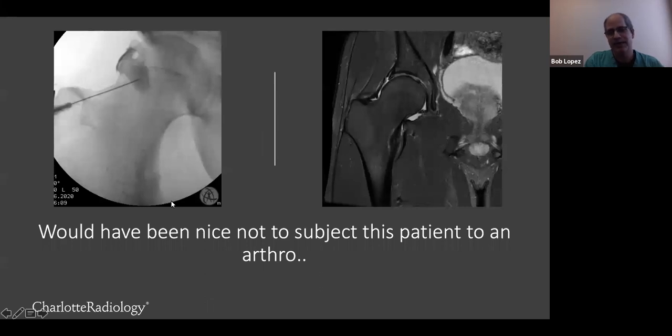Sometimes as clinicians you think somebody has a labral tear, and they don't. Here's a beautiful arthrogram from one of my partners showing the fluoroscopic image of the needle with contrast being instilled. This patient was a sports enthusiast with hip pain during and outside of workouts. There was a very tiny labral tear, but most importantly, this patient had an osteoid osteoma, which you can see in retrospect on the fluoroscopic image. So it actually would have been nice not to subject this patient to an arthrogram, but we made the diagnosis.